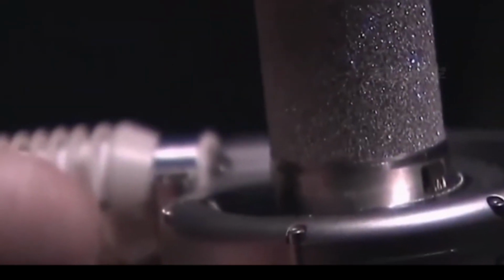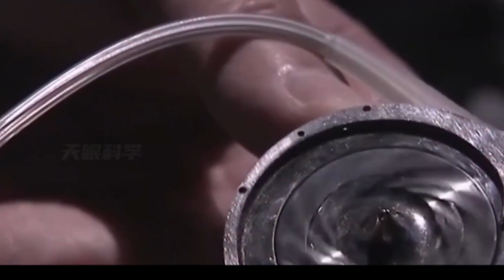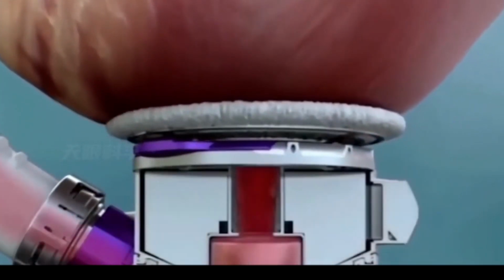After the blood pump is implanted, the cable is threaded out of the skin and connected to the external control device and battery. After turning on the power, adjust the blood pump speed according to the patient's heart function status. After the human heart is working normally and the circulation is stable, remove the extracorporeal circulation. After the surgery is completed, it is important to focus on checking all anastomosis sites for bleeding and the location of artificial heart implantation. After the entire process is completed, the chest can be closed, which is a rough surgical process.